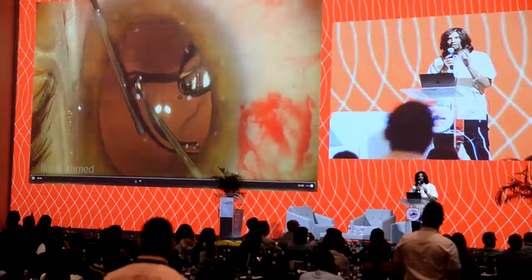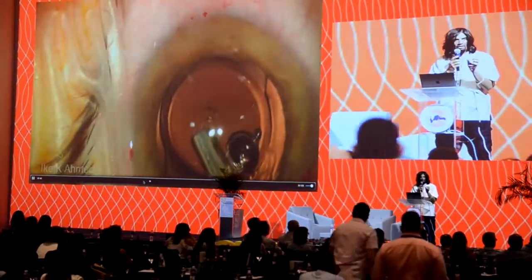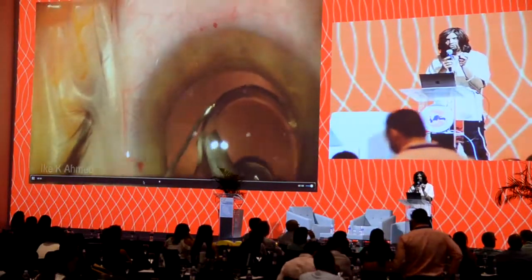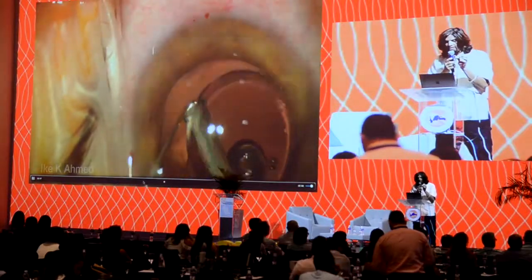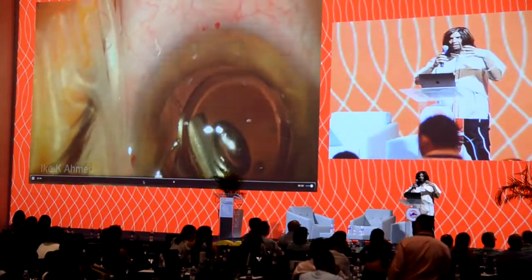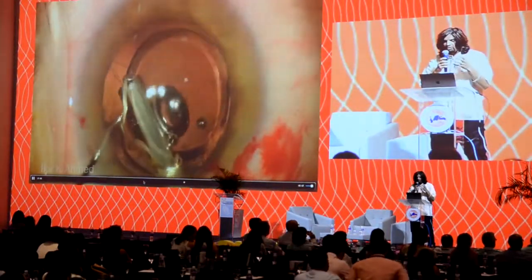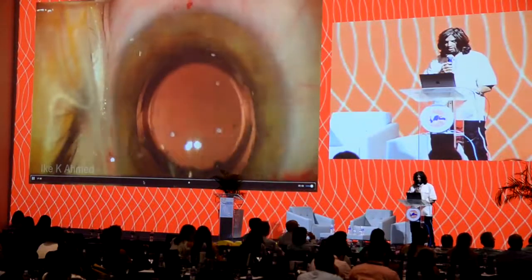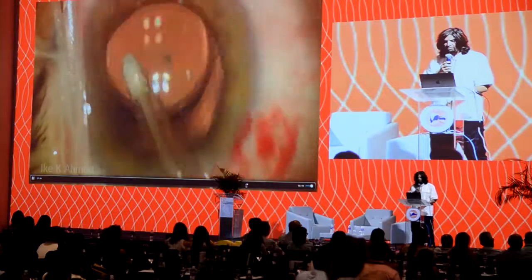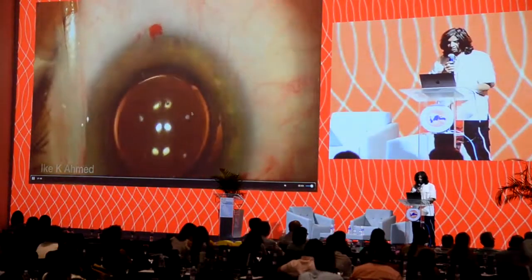And here we need to make sure we release the anterior and posterior leaflets. It obviously helps to have good capsule overlap over the optic. Now here, what we're doing is injecting a CTR to put it into the bag. This may, again, help prevent rotation by expanding the capsule, reducing the anterior-posterior distance, and creating a better sandwich around the lens. We rotate the lens back in position, remove viscoelastic using the irrigation aspiration, and we completed the case, and the lens is sitting well.